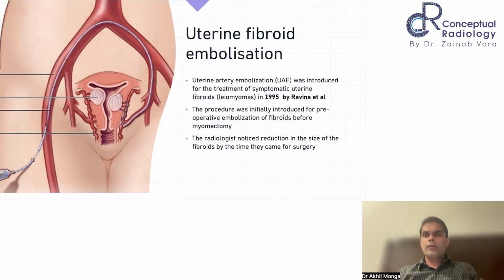So somebody got this embolization done. They got a surgical date 2 to 3 months later, and by the time they came for their surgery date and some scan was done, it showed that anyways the symptoms are gone, the size has reduced. So they didn't go ahead with the surgery. This is where we started developing this technique. We realized that what was started as a preoperative embolization itself can end up being curative for the patient.